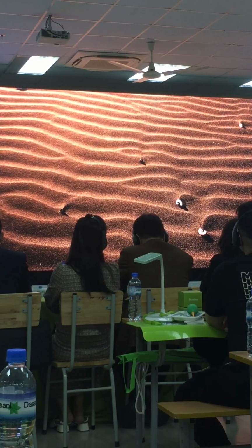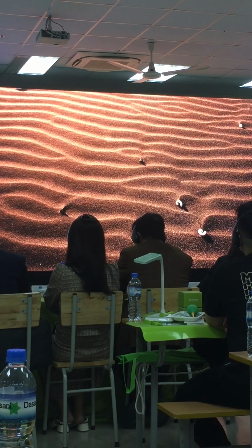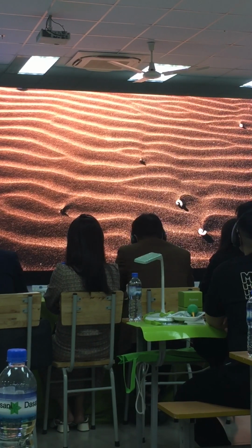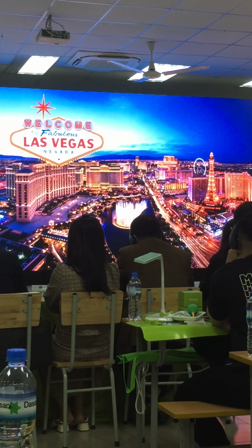A desert has barren soil and a lack of living creatures. As a matter of fact, the posterior maxillary region in our jaw is similar to a desert in many ways: poor quality, containing just a fatty marrow, and lack of bone quantity. Today's topic is how we could make an oasis in the poor posterior maxilla so as to place dental implants.